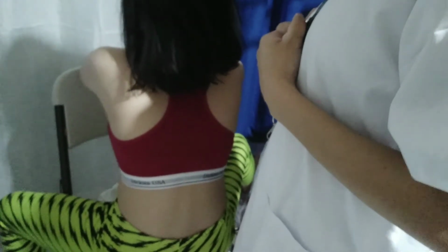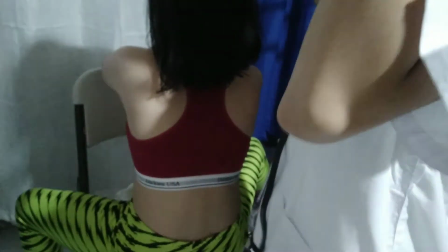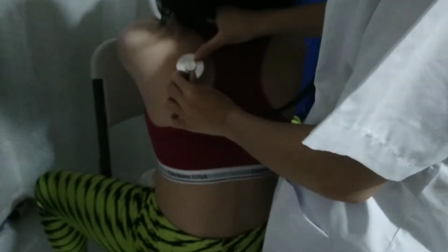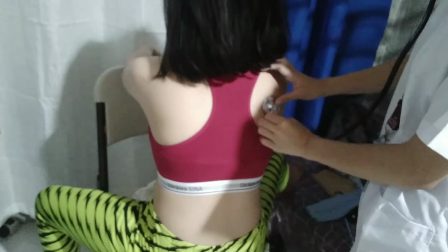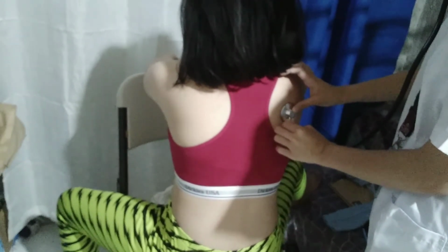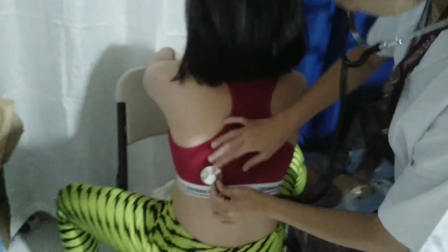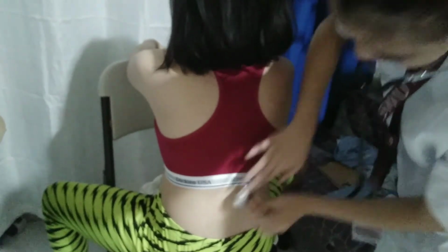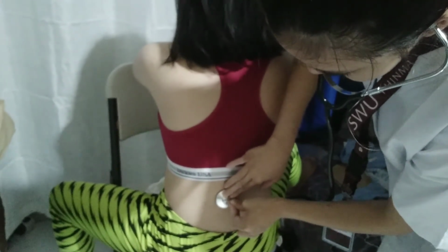Okay, so the last step is I'm going to auscultate. So, with this stethoscope, I'm going to auscultate now. So, ma'am, can you please inhale and then exhale slowly through the mouth? Again, ma'am. Exhale. Again. Exhale. Okay, so for the findings, it is all normal.